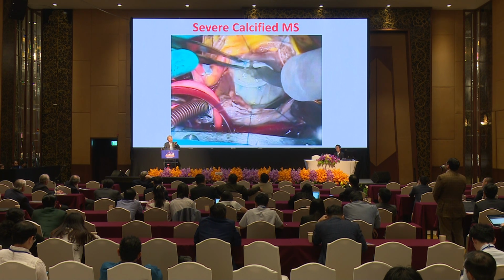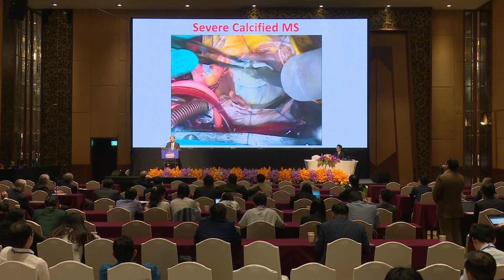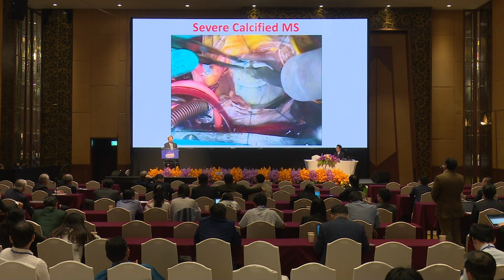But we'll have some additional problems on the anterior when it comes with the post-balloon MR, because the tear will usually go into the anterior. In this case, upon repair of the cleft, sometimes we have to do the augmentation of the anterior. So mostly we do something like that. It's technically more demanding, but usually at the end we can repair.